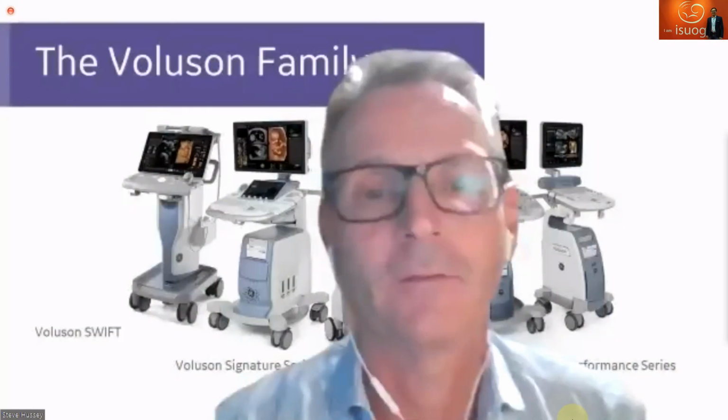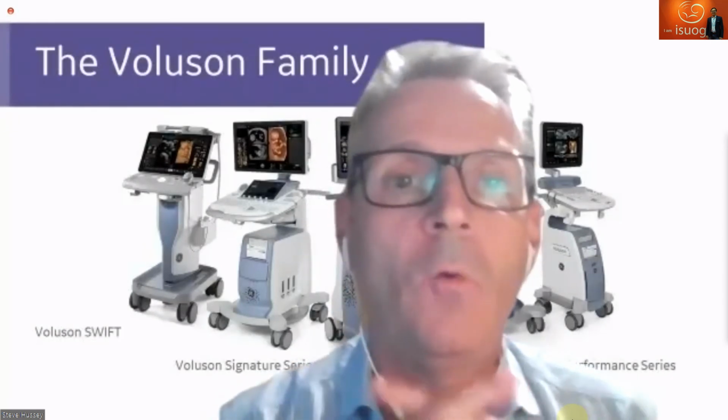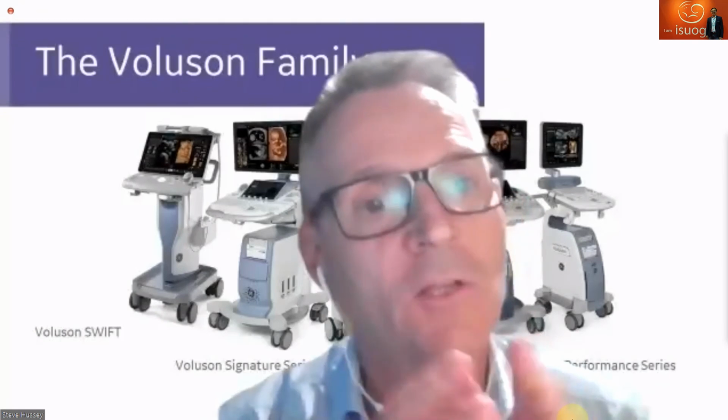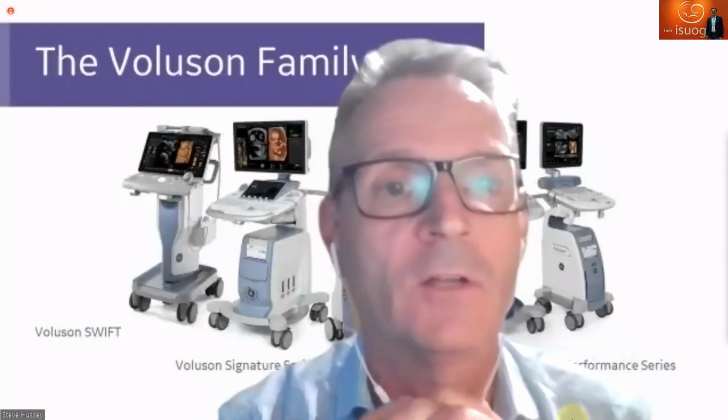Okay, excellent. Thank you. Perhaps we can combine the next 2 questions together because they're based around color Doppler. One is, how do you optimize your color Doppler image once you start scanning? What are the first things you work on with your color Doppler image?